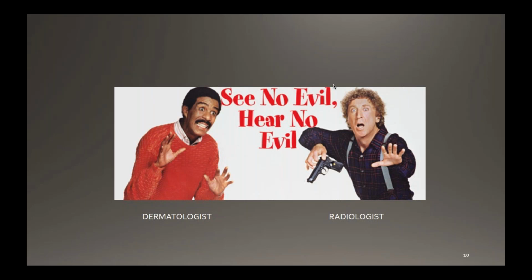Then good communication, giving good information that is useful for a better personalized treatment for the patients of the dermatologist, is going to be key if you want to start doing ultrasound for your dermatologist. Let's go with the three main fields in which dermatologic ultrasound is useful, and I'm going to explain what information is relevant for us as dermatologists and that you can offer so you can improve your relationship with the dermatologists that are going to require your exploration.